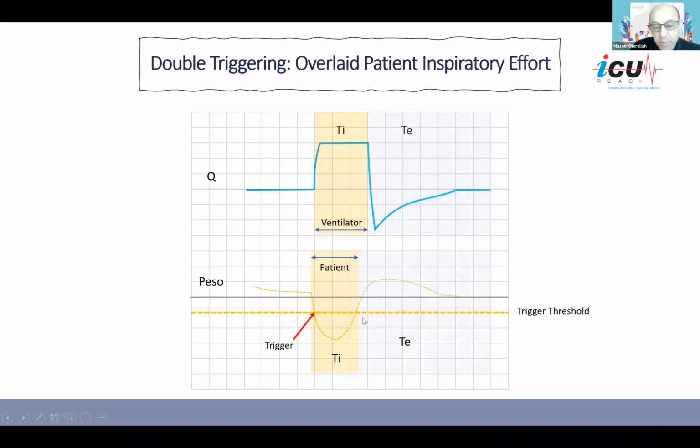So this is in normal condition. This is perfect actually, because that's what you want. You want the patient to exhale. You want the patient to finish inhalation prior to the ventilator inspiratory time. And you can see that the pressure goes up to a positive side of the pressure curve, and you can see the expiration nicely with the expiratory flow decelerating back to the zero line.